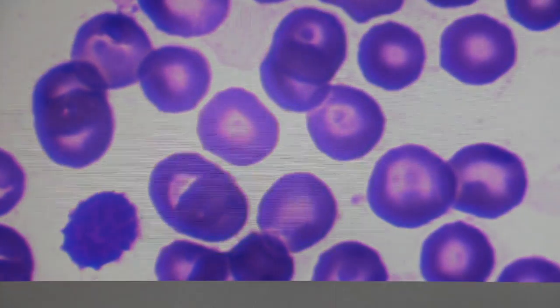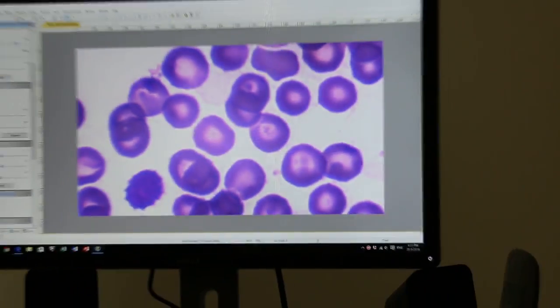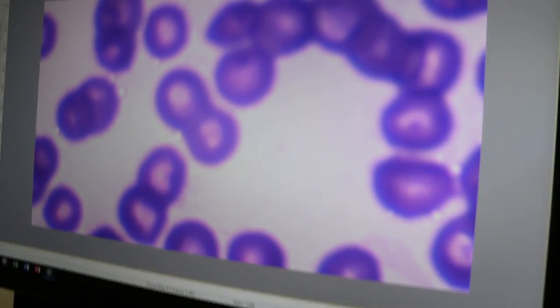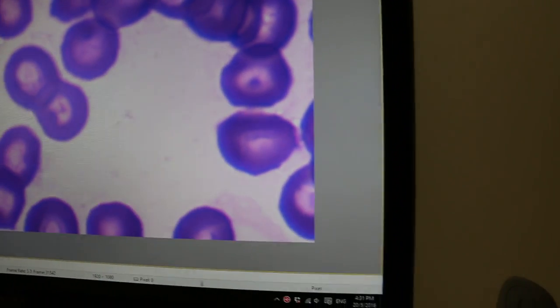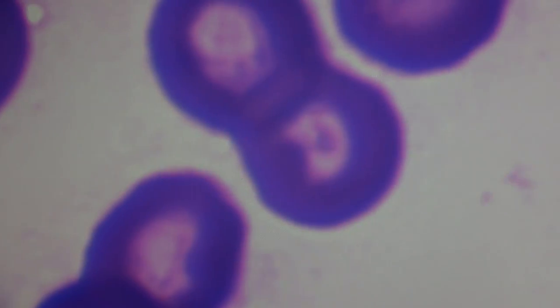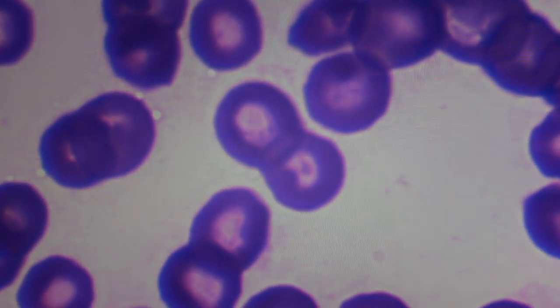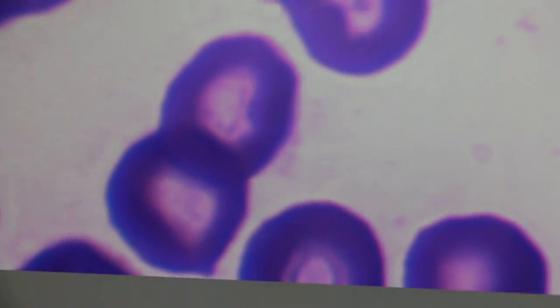So the appearance of the parasites in the red blood cells, Babesia canis, depends on the timing. If it's too early, there won't be any. And if it's at the right time, you can see lots of it. You can see lots of the Babesia canis inside the red blood cells. But if it's too early, you can't see anything because they have not appeared yet in the peripheral blood smear.